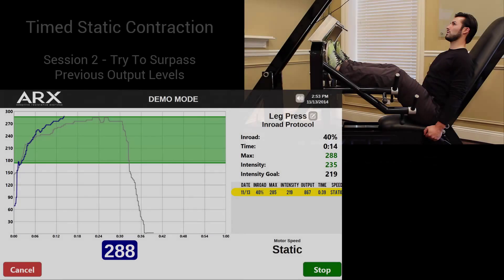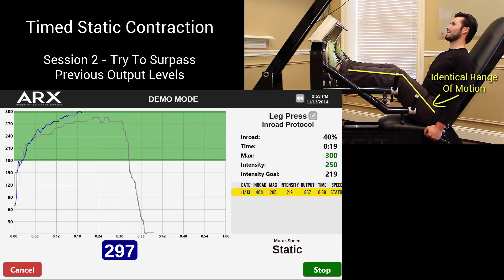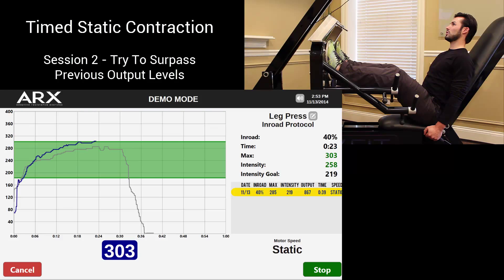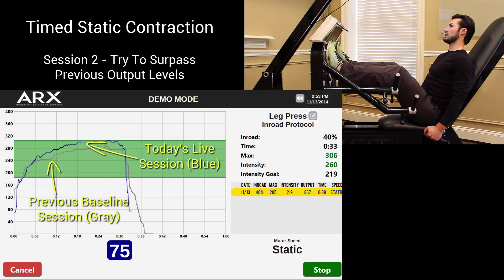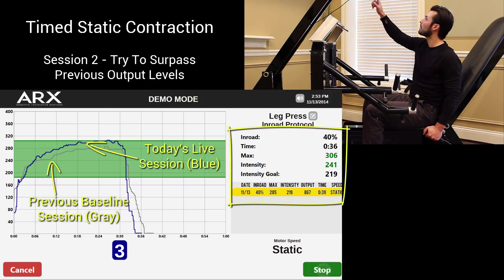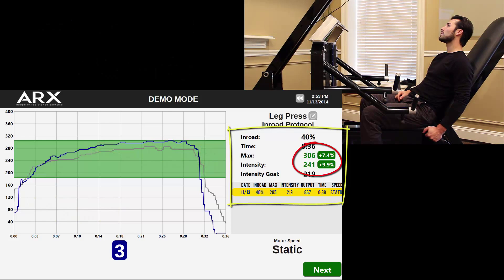The baseline has now been set, and the idea is that in upcoming sessions he will attempt to improve his numbers incrementally. For his second session, the machine is placed in the exact same position for the exact same joint angle, so we have an apples-to-apples comparison, and the same protocol is followed. As he goes along, he can see his performance tracked as a real-time comparison to his previous baseline, which you see as the gray line — the pace car, you could think of it. As he finishes this second set, he can see his improvements displayed visually by looking at the two lines, and also displayed numerically by percentages over on the right.